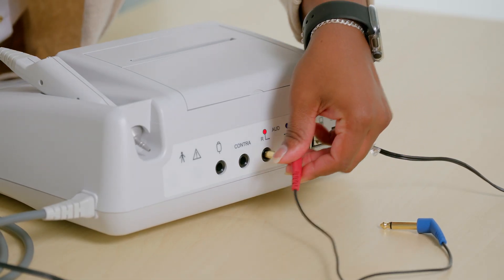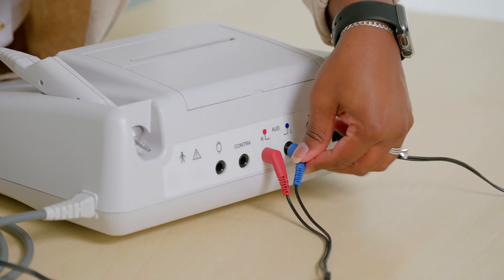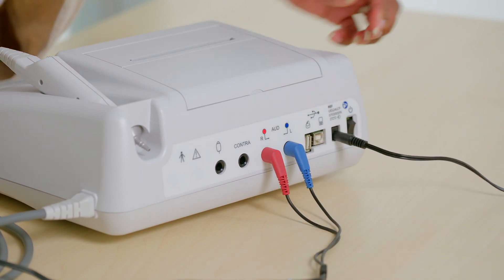Before testing a patient, ensure that all transducers that will be used for testing are plugged securely into the back of the instrument. For the audiometry module, ensure that the right earphone is plugged completely into the jack labeled R and the left headphone is plugged completely into the jack labeled L. If there is a contralateral reflex earphone or an optional patient response switch, make sure they are also plugged completely into the appropriate ports on the back panel.